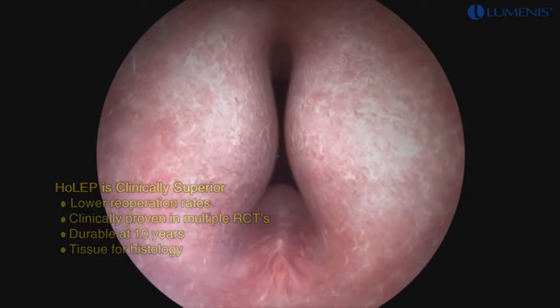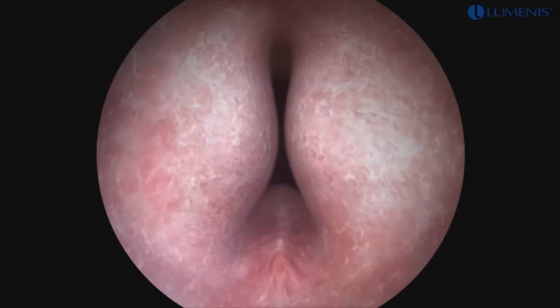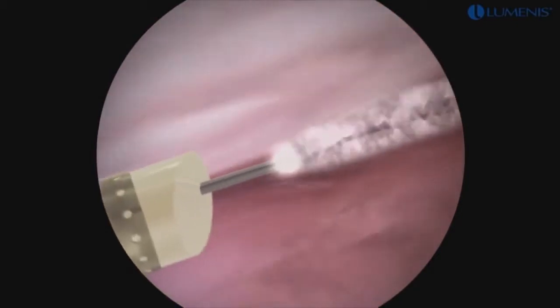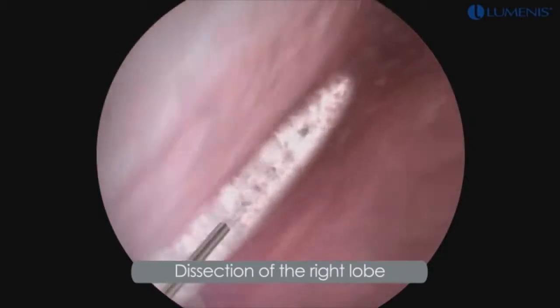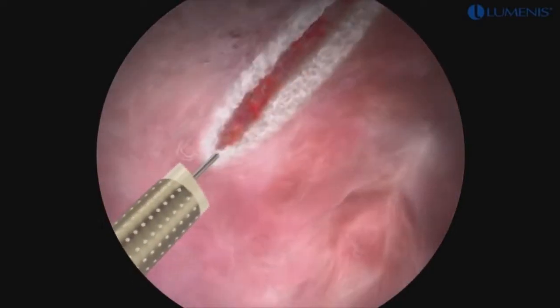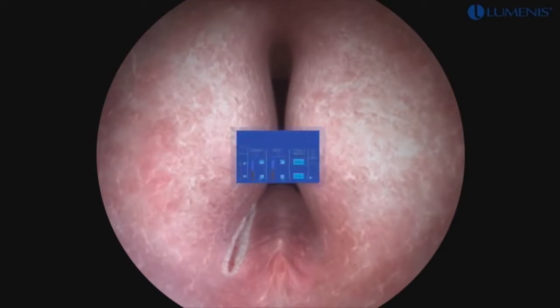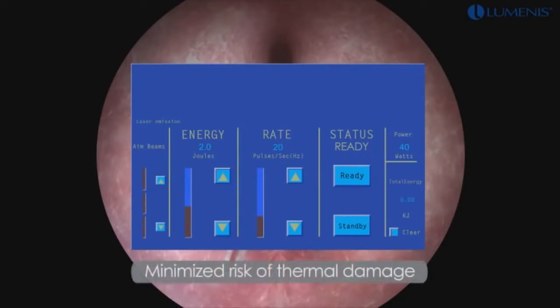During the enucleation, the laser settings are adjusted to 2 Joules and 50 Hz for a total power of 100 watts. Beginning at the level of the bladder neck at the 7 o'clock position, a groove is formed by cutting with the laser along the sulcus to a point just lateral and proximal to the verumontanum. This groove is deepened to the level of the surgical capsule of the prostate. Dissection of the right lobe is started by proceeding lateral to the verumontanum in a transverse fashion. Laser settings are adjusted to 2 Joules and 20 Hz during the process of apical dissection to prevent thermal injury to the sphincter.